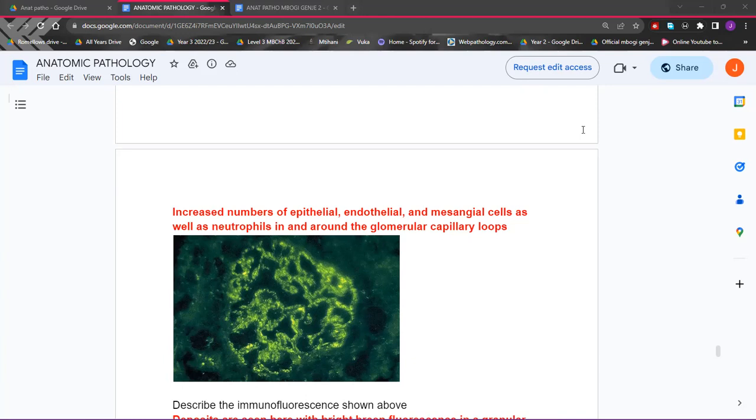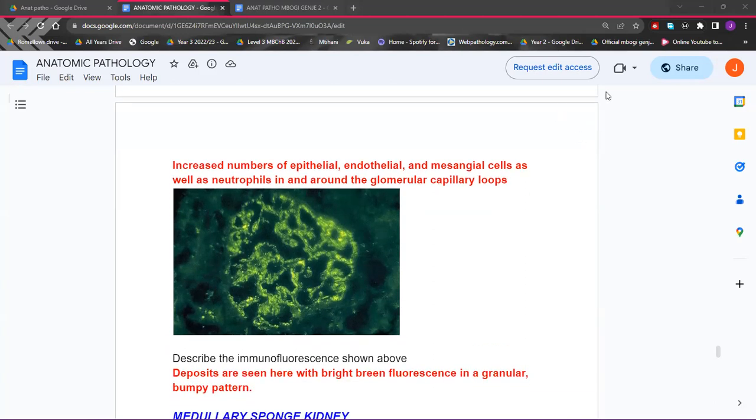For immunofluorescence, when you see the IgM, IgG, and C3 deposits in the glomerular basement membrane or mesangium, you have this starry sky appearance. Looking at the same specimen under electron microscopy, you'll see a hump-like, hill-like appearance, which is what we call humps. That is how you describe the features of post-streptococcal nephritis. The image below is immunofluorescence, showing the starry sky appearance, and the image above is the humpy appearance. Is that better understood now? Any questions? Move to the next.